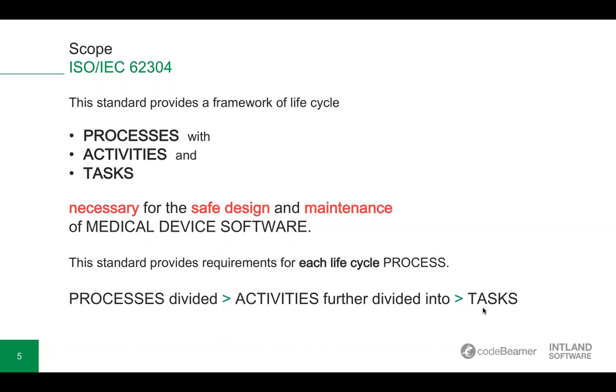The standard provides requirements for each lifecycle process. These processes are divided into activities and then further divided into tasks. This is what you have to execute in order to later on show compliance to the FDA or the respective authority.